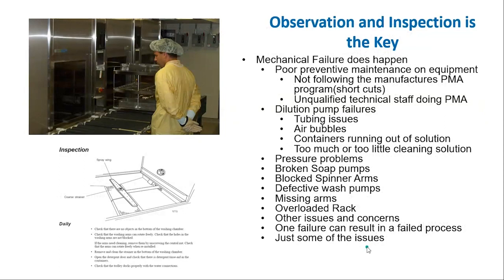Observation is important — don't just push that rack in and walk away. Watch it for a few seconds to see what's going on. You want to make sure pumps are working, spray arms are all there and not clogged. You can have broken pumps for water or detergent, air or blocked arms, missing arms, or people can overload. All these things impact whether instruments are clean, and one failure can result in a complete process failure — or they can compound and cause major issues.